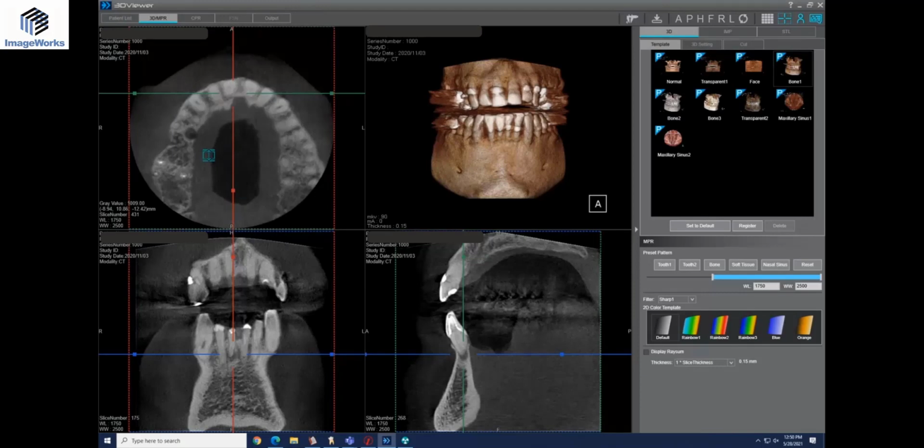But there was no problem explaining it to him because I showed him his case and he went, wow. Very impressive pictures. So to your point, imagine if the patient, a layperson who is asymptomatic, has no reason to think there's anything wrong.